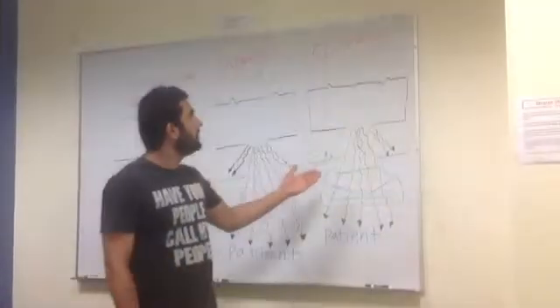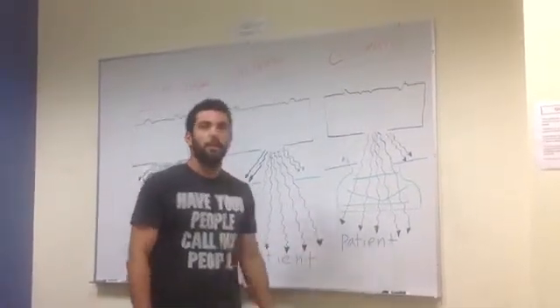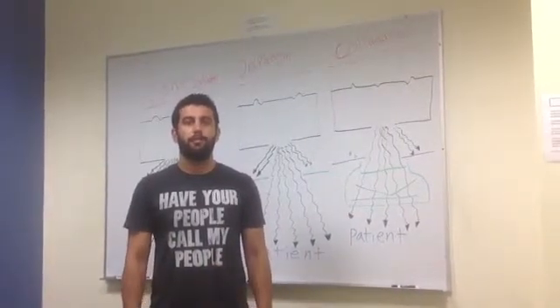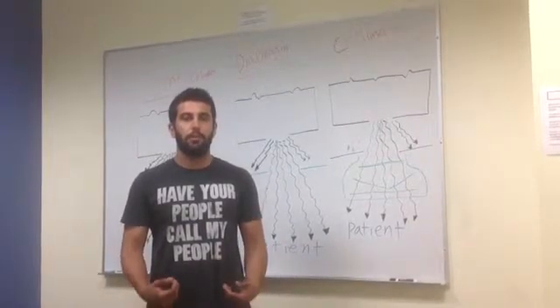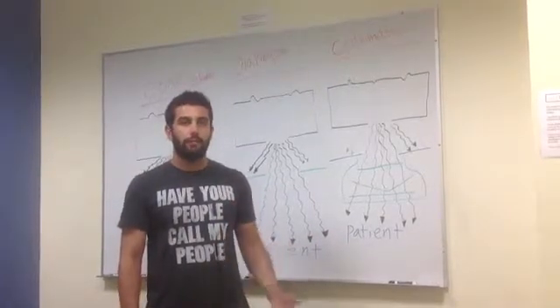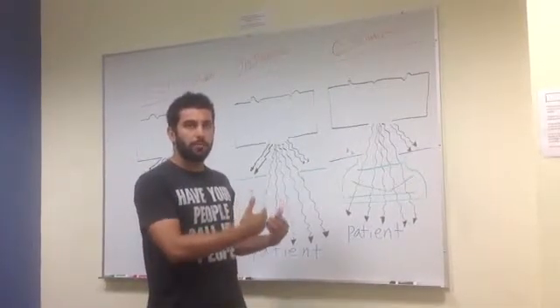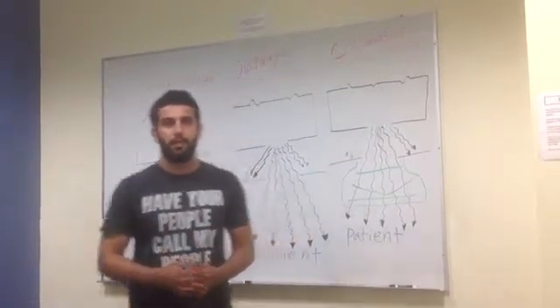The third beam restricting device I would like to explain to you is the collimator. The collimator is the most effective at reducing patient radiation dose. As healthcare providers and as X-ray technicians, it is our utmost concern to make sure the patient is safe. Although there is no safe radiation dose, the collimator is the best and most effective one at reducing that, so limiting the risk factors for the patient.